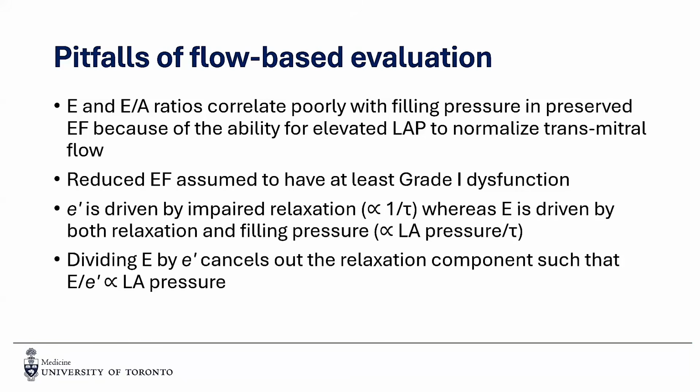And so the reason specifically why E to E prime is very helpful is because of a little bit of math. And I've organized this a little bit so that it makes sense, hopefully.